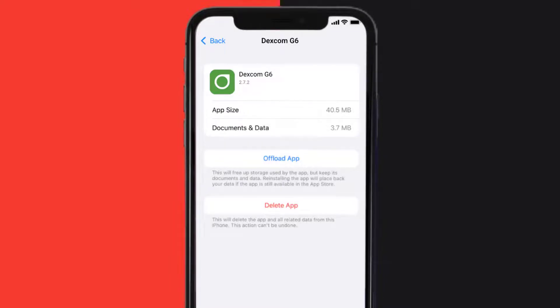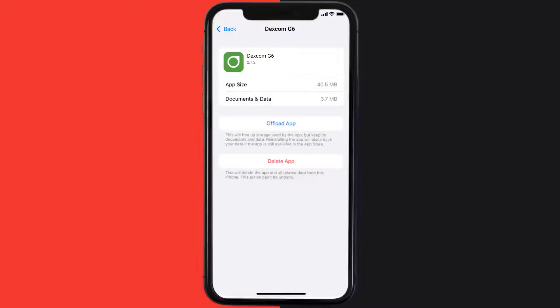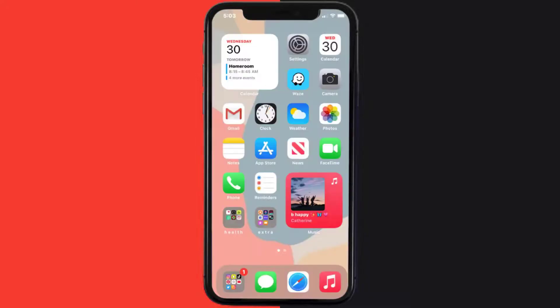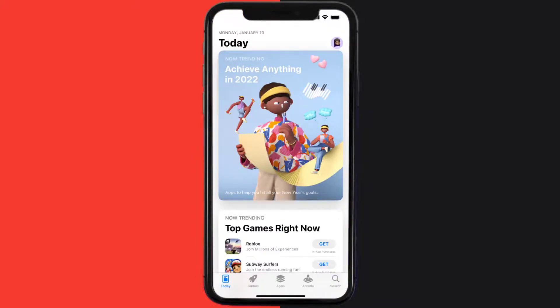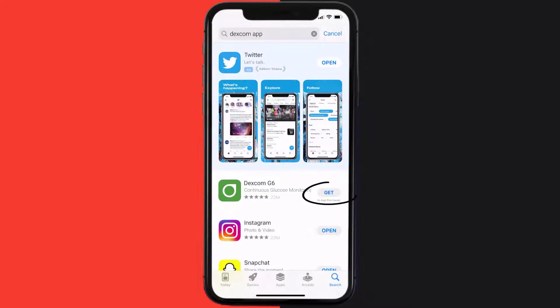This should fix the issue, but if it doesn't, then you need to completely reinstall the app. Follow the on-screen instructions to navigate all the way to the app page. Once you're on this screen, tap on Delete App to uninstall the app from your device. Once uninstalled, open up App Store and search for the Dexcom mobile app in the search bar, then click on Get to install it back on your device.